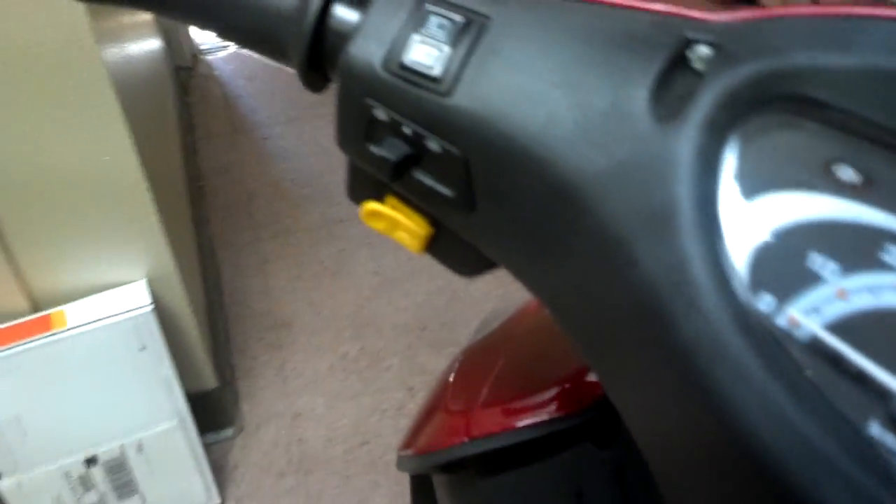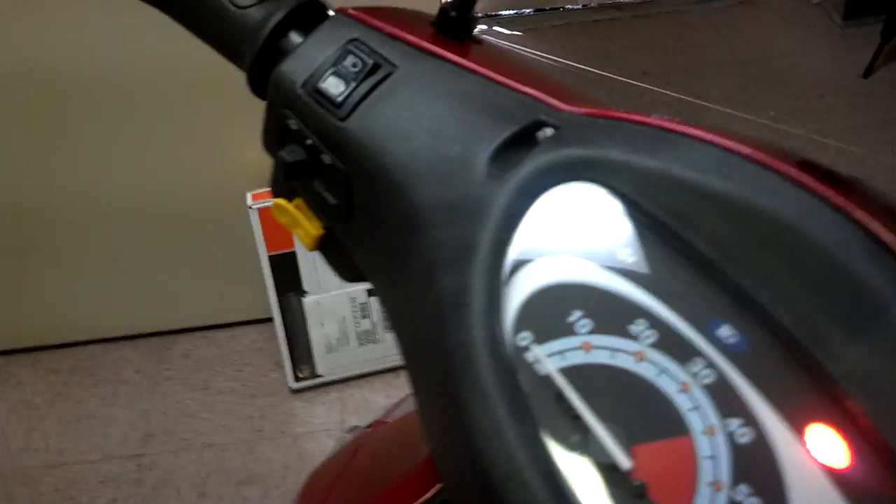One thing you've got to understand is that the Pride scooter comes with flat-free tires. Now if that's an option for where you live, that comes with it. This scooter comes with pneumatic tires, which is important because it changes the comfort of this scooter. As you can see, I turned it around in the kitchen and I'm driving it in the doorway and around — so you can see how simple it is.